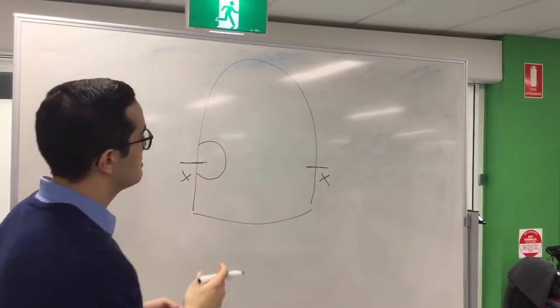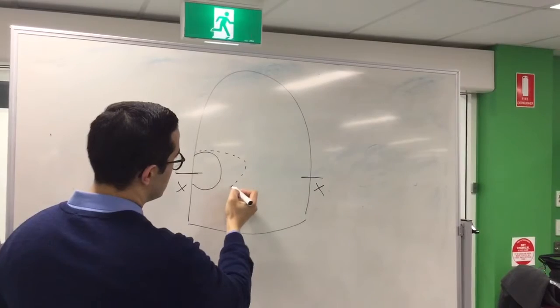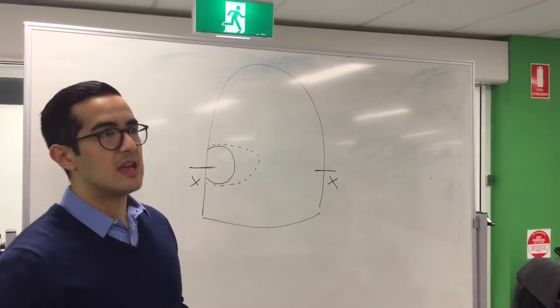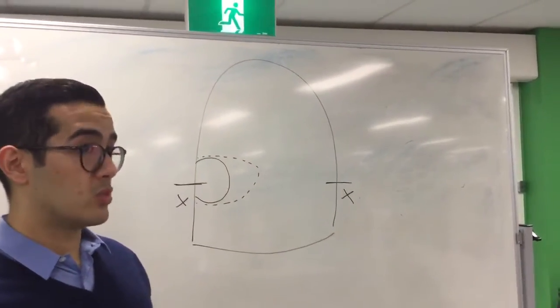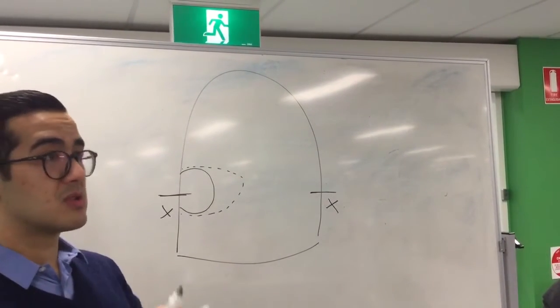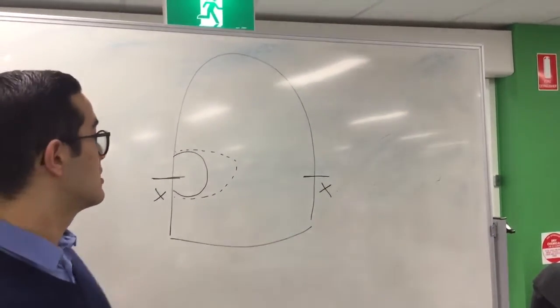So we want you to be mindful not to start too centrally, because if you start too centrally, you get that elongated C shape. And that's not really what we want you to do, okay? Now, it always depends; your cavity will always be dictated by how big the caries is in real life, okay? So today Kathy's made you some images which show you the extent, okay? If you're unsure, have a chat with your tutor if you need further clarification, okay?